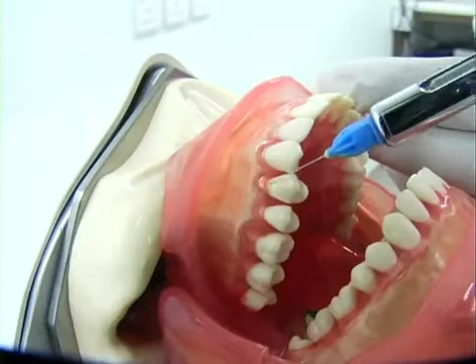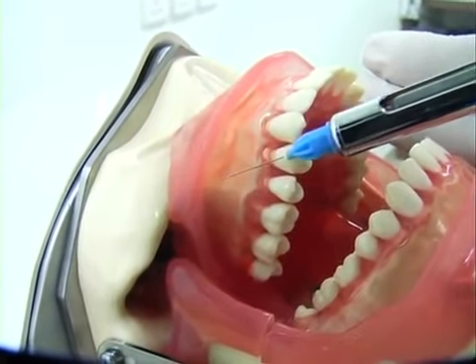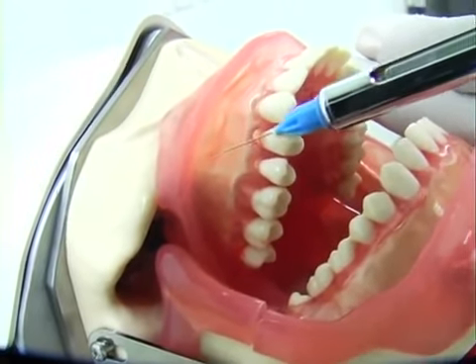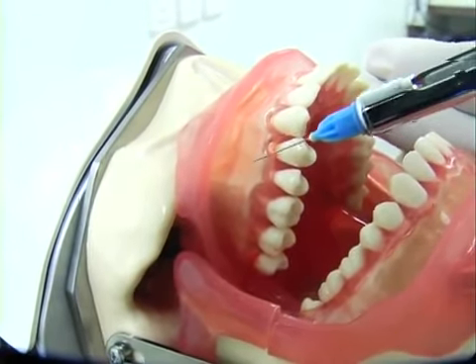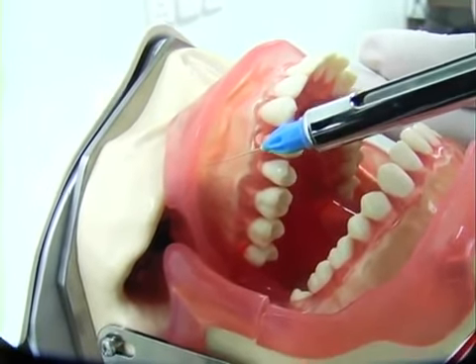Similarly, in the posterior teeth, you have to deposit at the site of the root of the tooth which has to be anesthetized. Say, for example, if you want to anesthetize 1-4, then you have to deposit the solution around here somewhere.